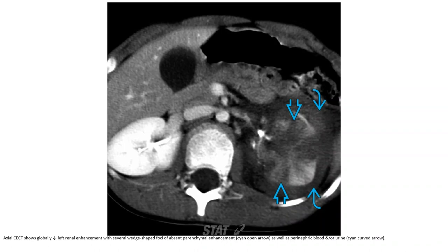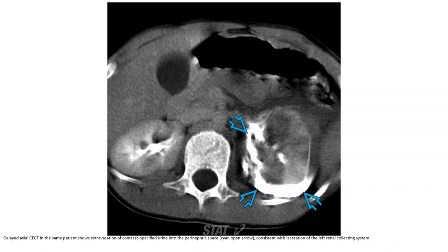Axial contrast-enhanced CT shows globally decreased left renal enhancement with several wedge-shaped areas of absent parenchymal enhancement, as well as perinephric blood and urine. Delayed axial contrast-enhanced CT in the same patient demonstrates extravasation of contrast-opacified urine into the perinephric space, consistent with lacerations of the renal collecting system.